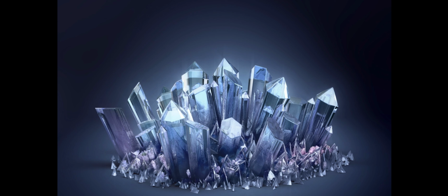The useful cross benefit is that whilst it can generate that sound wave, it can also work the other way around. So when sound comes back and hits the crystal, it causes it to deform and vibrate, and that will generate an electrical impulse. So not only can it create sound, but it can turn sound back into electricity.